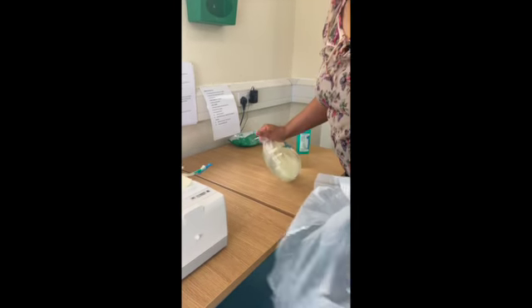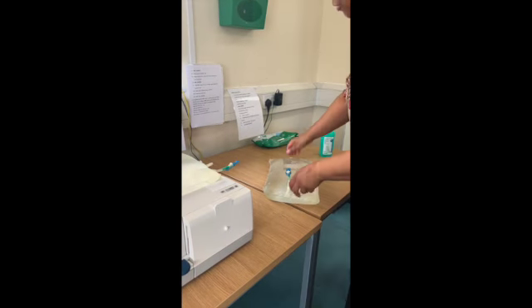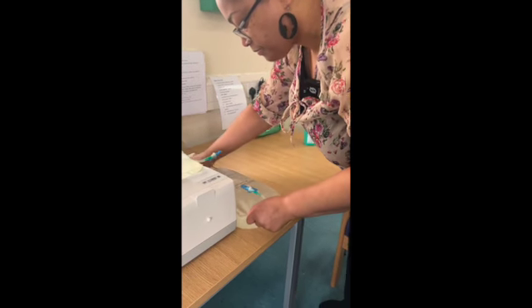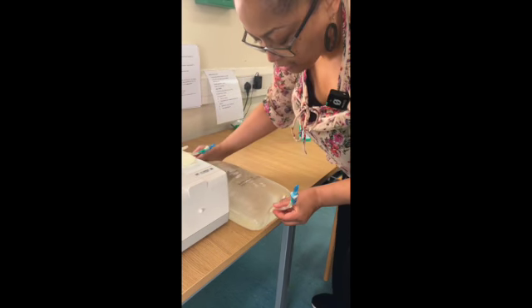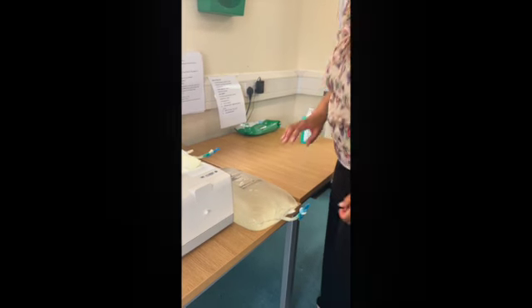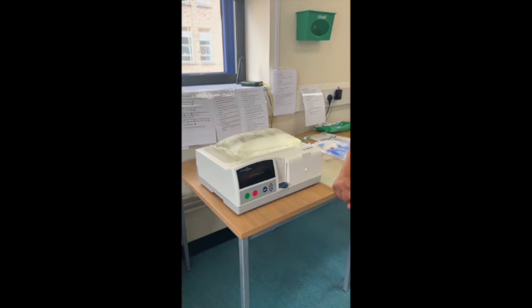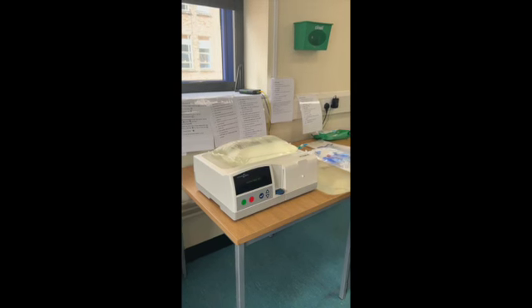So I'm going to put the next bag next to the machine, and all the rubbish just goes onto the floor because I can't afford to risk contamination. This bag goes close to the machine, and I've got to make sure that nothing is touching the end of this. So the next thing I have to do is press the green button. It's now told me to load the set.